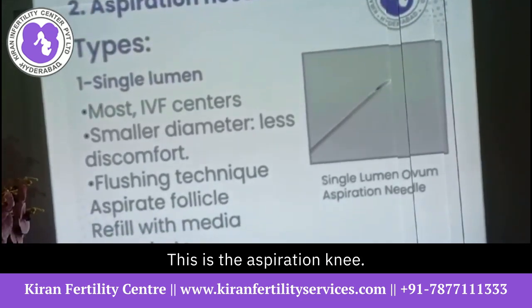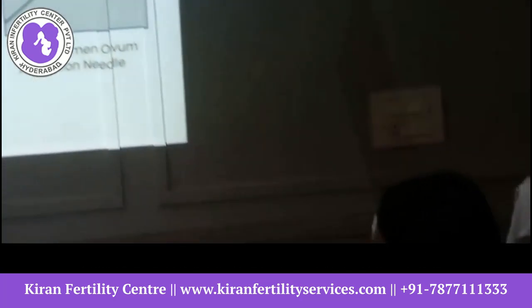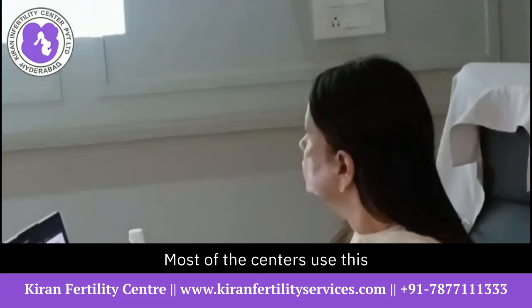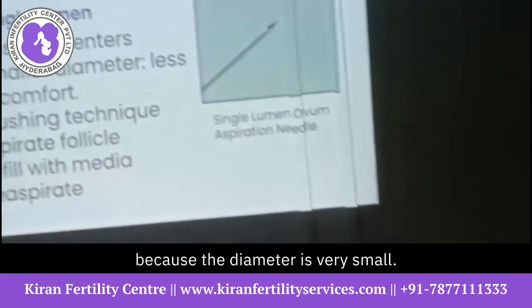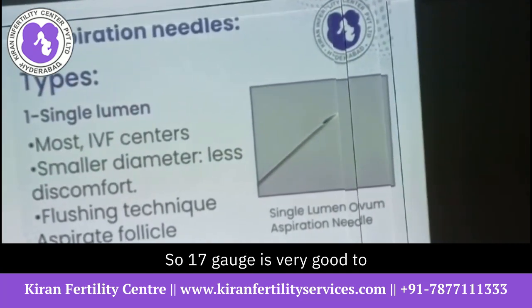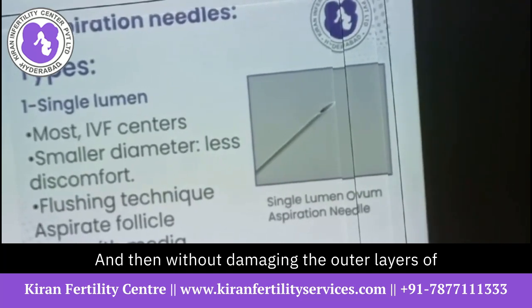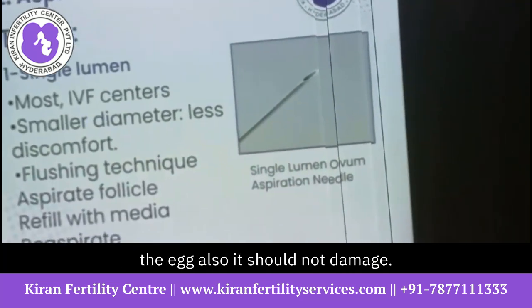This is the aspiration needle. This is a single lumen needle we use in our hospital. Most of the centers use this because the diameter is very small. It is 17 gauge. So 17 gauge is very good to get the egg, and without damaging the outer layers of the egg also, we should not damage.